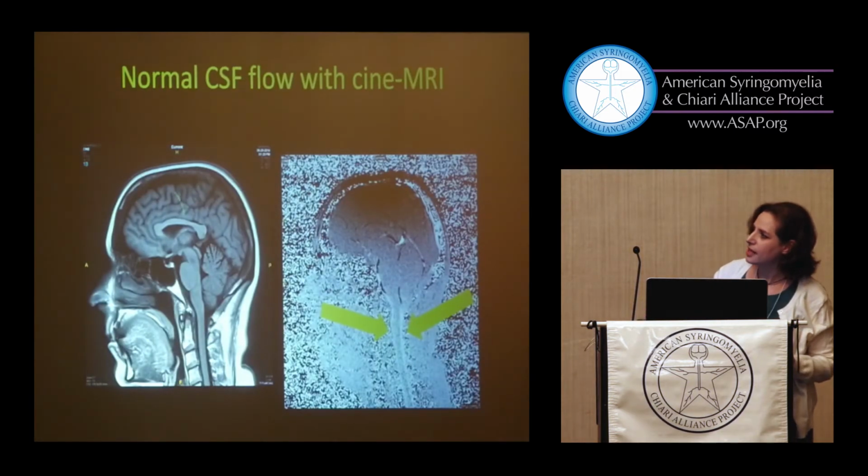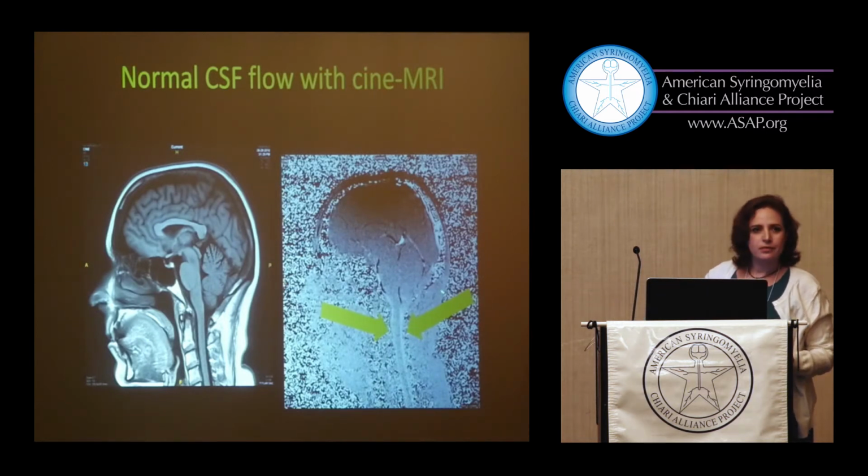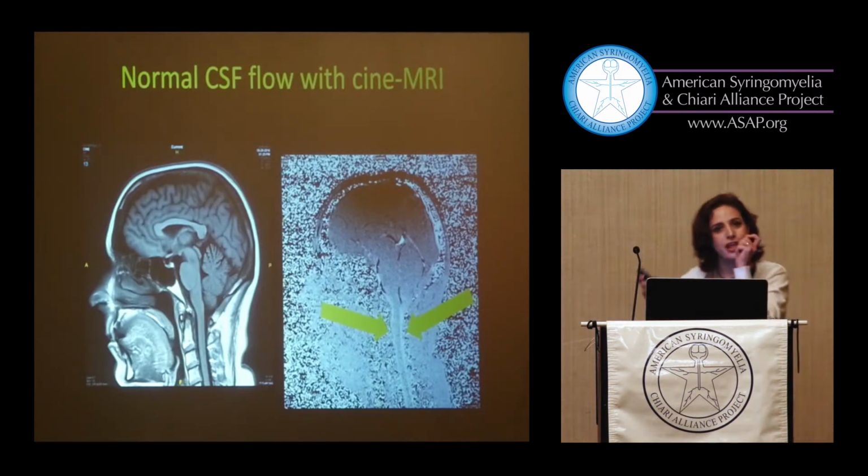Here's the normal case. That's the same brain I showed you before. This is a very, I would say, inscrutable looking image, if you're not used to looking at them, and I have to tell you for some people who are. This is the kind of image we use. And I'm just going to call your attention. This is the same brain. This is the brain here. This is the brain stem. Here's the spinal cord, that gray with white on either side. And I wanted to call your attention to that white on either side.